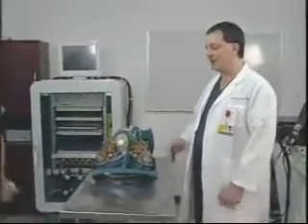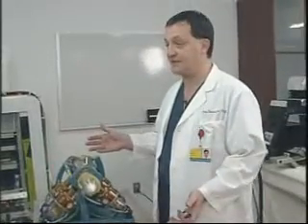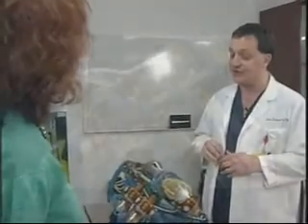Yes, indeed. We just made this robot, which is entirely made of plastics. It doesn't use any electricity. It uses air to move and light for the sensors.